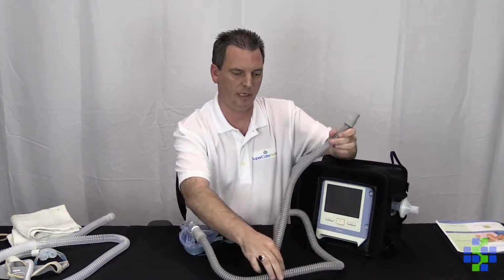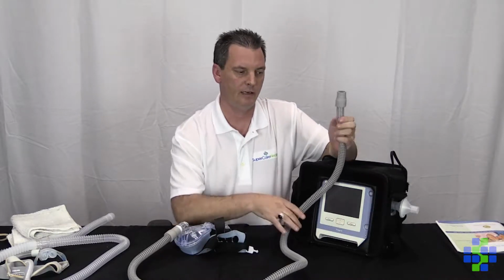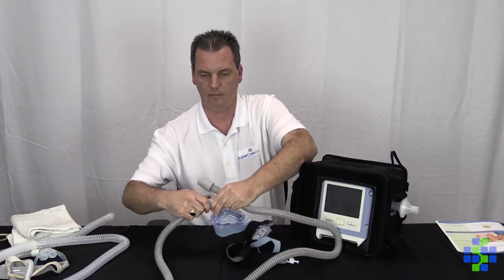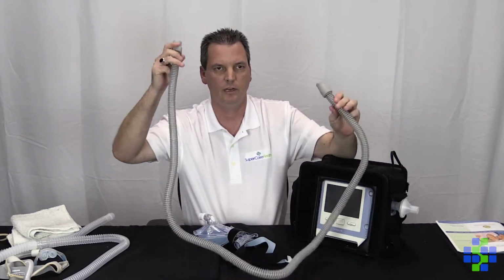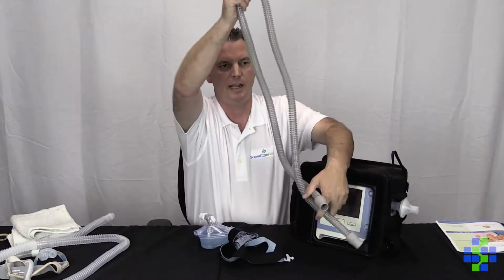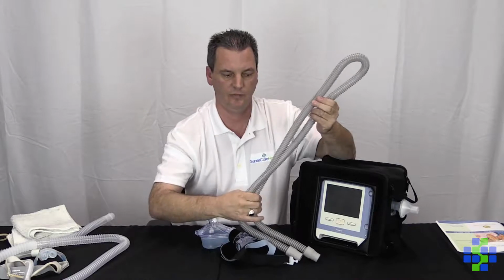And I'll start with this tubing. We're going to wash this tubing. I recommend washing it every day. Soap and water. Just run some soap and water down through it. And you're going to swish it around and then rinse it out with water thoroughly, and you can hang it over your shower door, or you can put it outside if it's convenient for you.